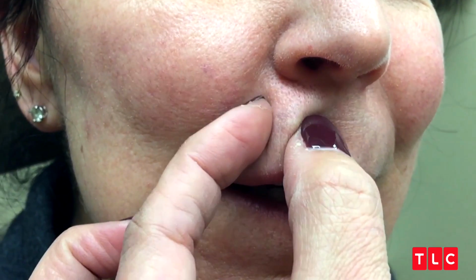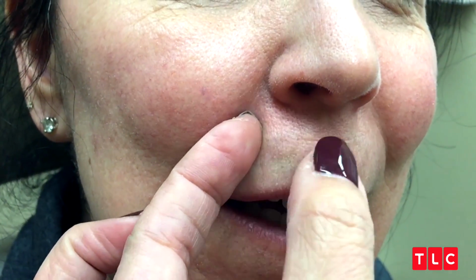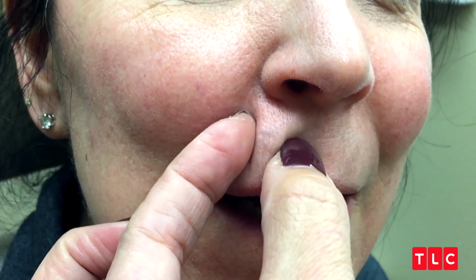It's called, Can You Spot This Blackhead on the Upper Lip? I called it that because initially I really couldn't see this blackhead on the upper lip. You can't see it unless she stretches her skin on her upper lip, and then it looks just like a little button or a disc. What's really satisfying about this kind of blackhead is that if you just numb the surface of the skin and make a little nick in the surface, it pops out or slips out.